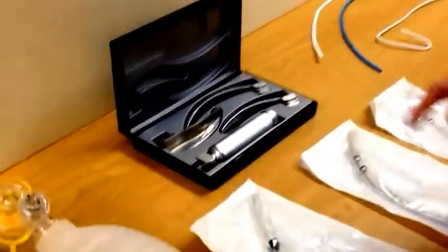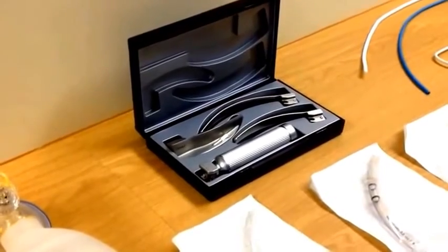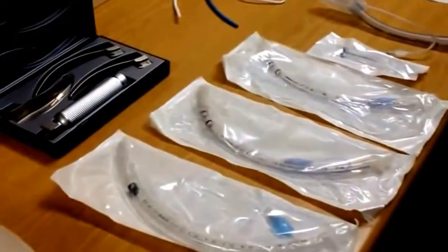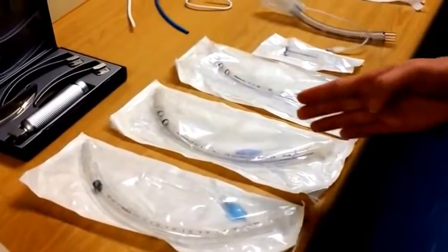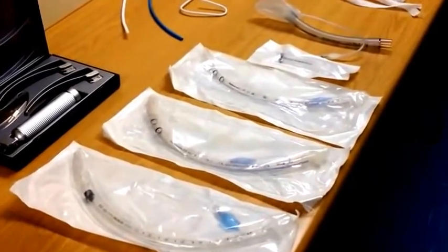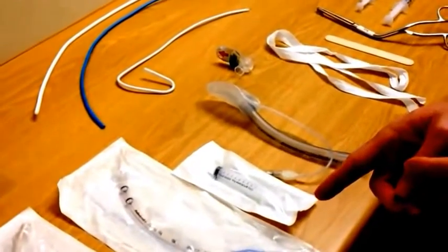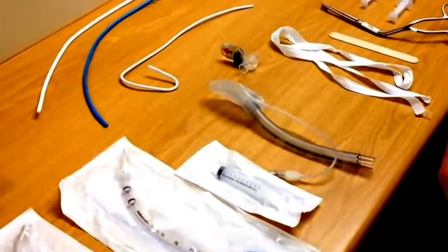You should have a laryngoscope with a selection of blades checked and in good working order, and you should have a selection of sizes of endotracheal tubes. We suggest the size you're going to use and one size above and one size below. You should have a 10ml syringe to inflate the pilot cuff and the cuff of the ET tube.